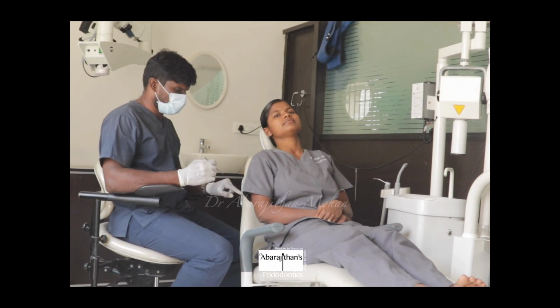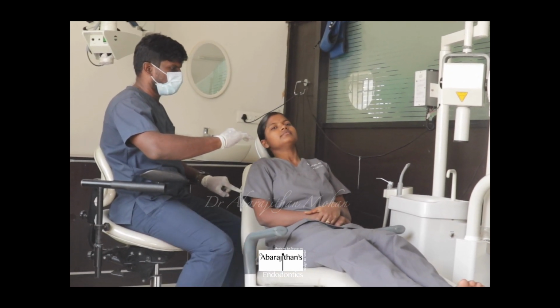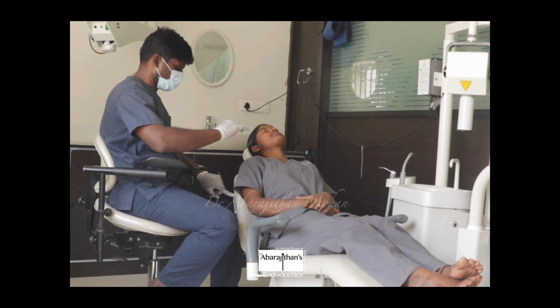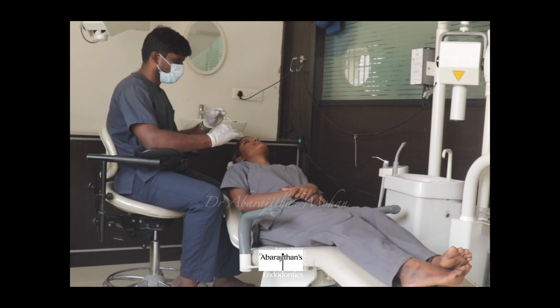So once the patient is made to sit, you need to inform the patient that you're going to adjust the chair height, and the first basic adjustment that you need to make is to bring the patient's headrest back to your elbow level. This is the preliminary adjustment that you need to make to the patient's chair. Make sure you don't adjust your operator's stool after this, because I don't want to lose the preliminary things that I told you, the arm and the thigh parallel to the floor, so that I can maintain a good working atmosphere.